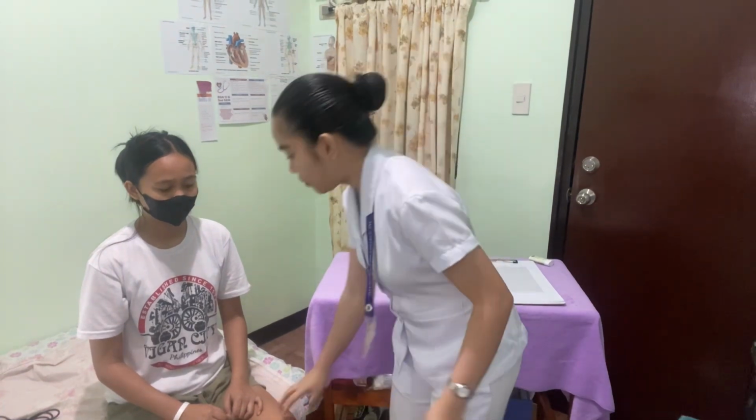which could hinder me from taking her blood pressure in a particular limb. So, since my patient is sitting, I'm gonna need to make sure that both of her feet are on the ground because the blood pressure increases if the legs are crossed. I'm also gonna have to place her arm at heart level because if the arm is at a lower level, then it would give us a higher blood pressure reading.